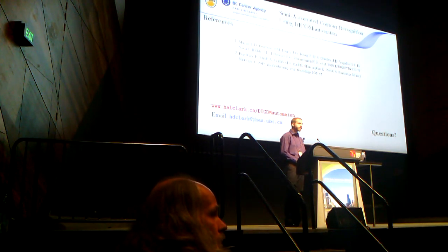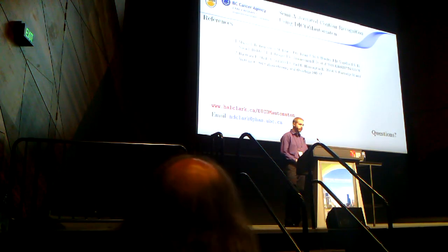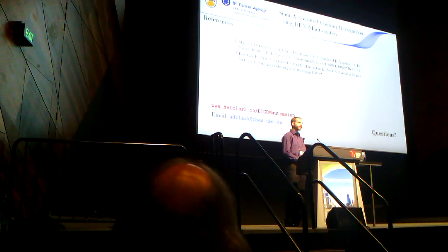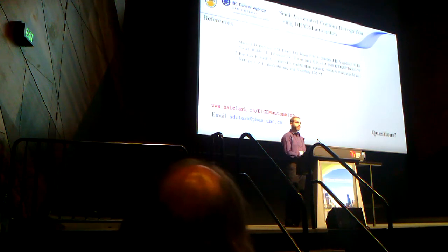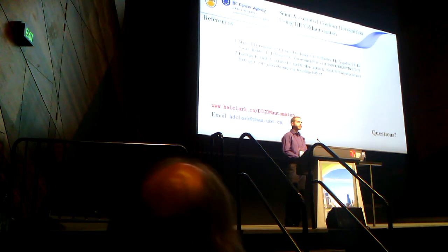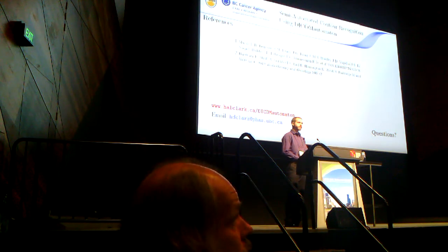Yeah, very interesting. It seems like you could take it another step where you include both the contour information and the name information to help resolve both. Definitely. No patients, or however many patients, have more than two parotids. So there are some hybrid techniques that we can do. Actually, we've looked at them, and recognition does improve.